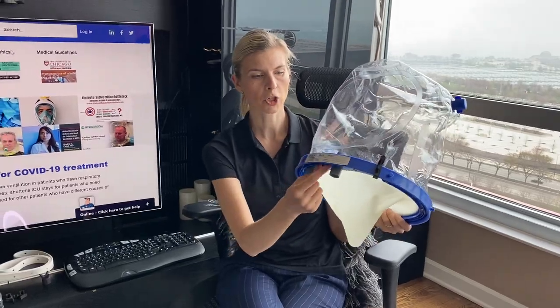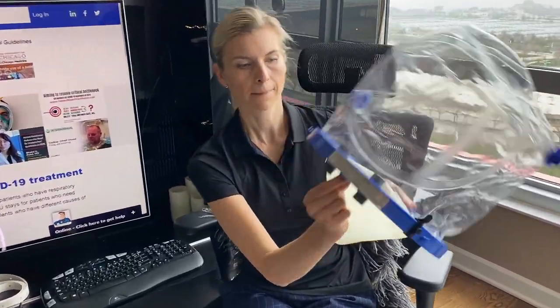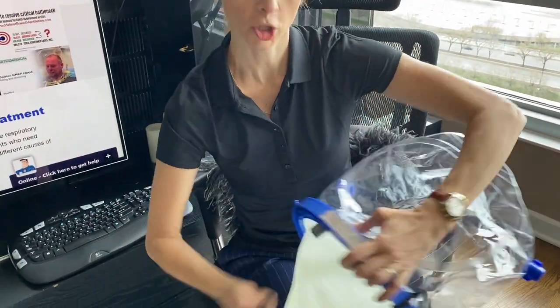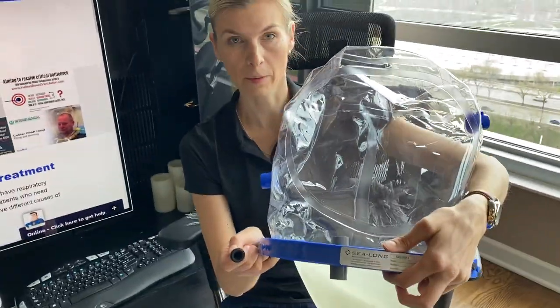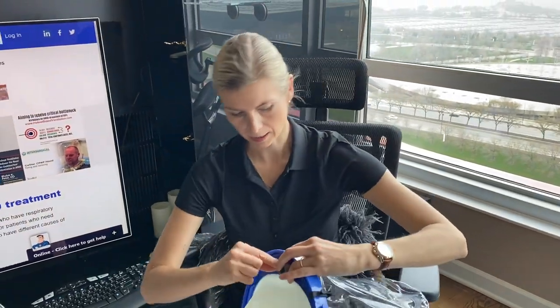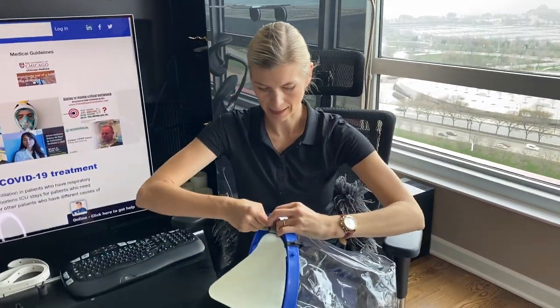It has a patient access port — just a little clip that you pull out if you want to suction the patient or give them a sip of water or liquid diet, and it just puts back in place.